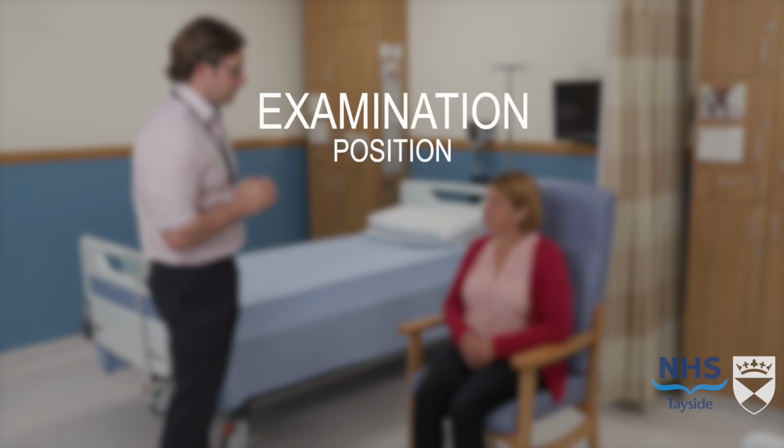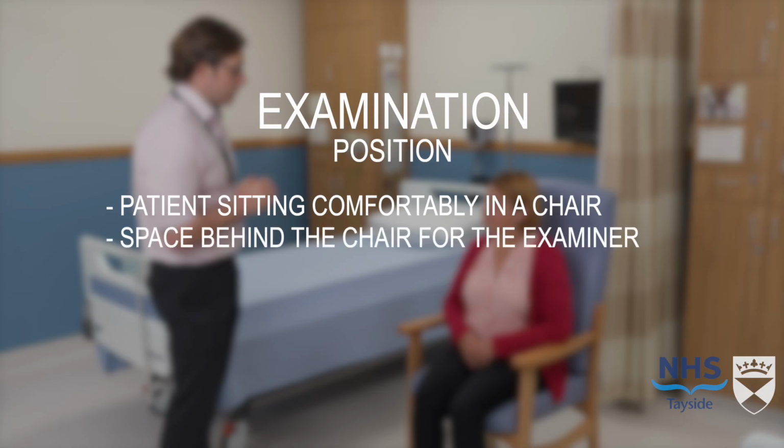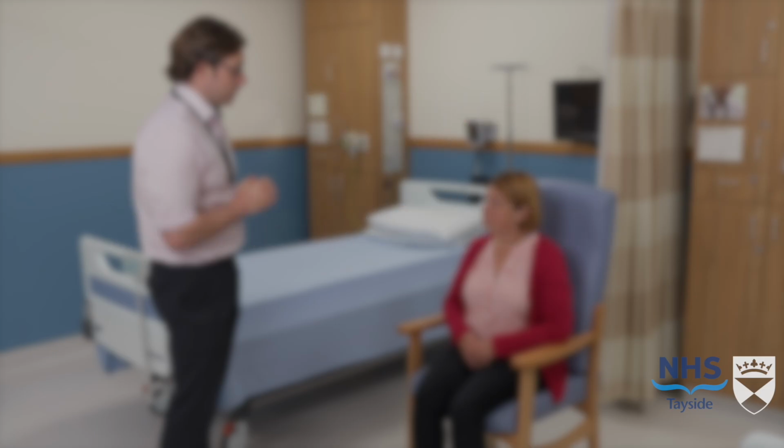Ideally, the examination is best carried out with the patient sitting in a chair with space available behind the chair for the person carrying out the examination. Assess the patient for any distress and ensure they are well enough for you to proceed.